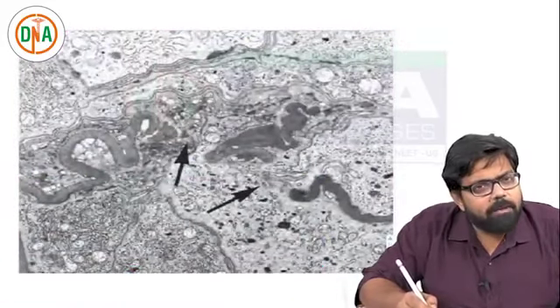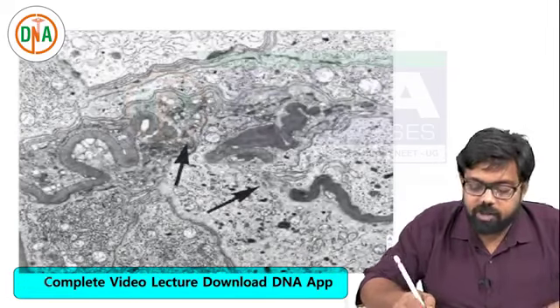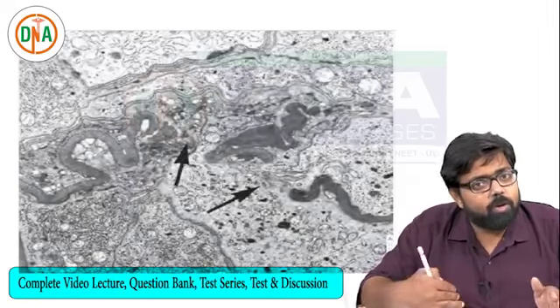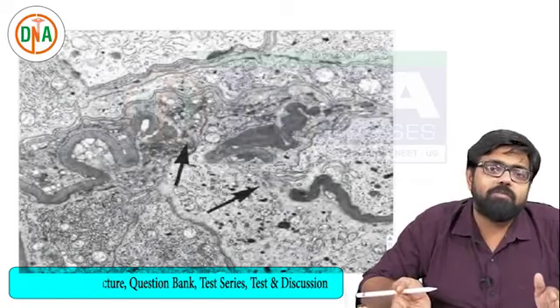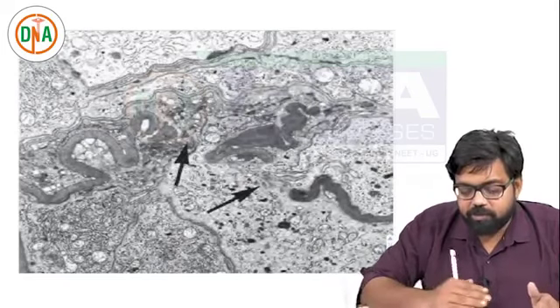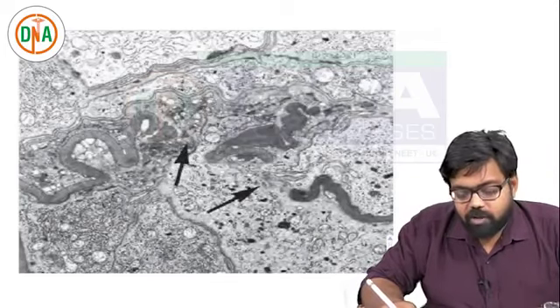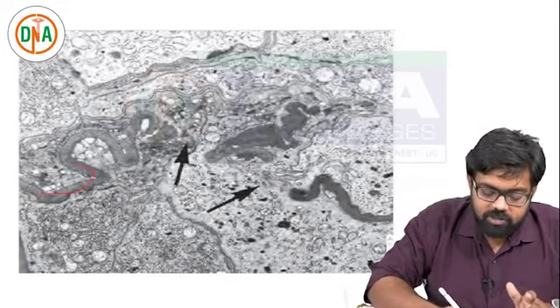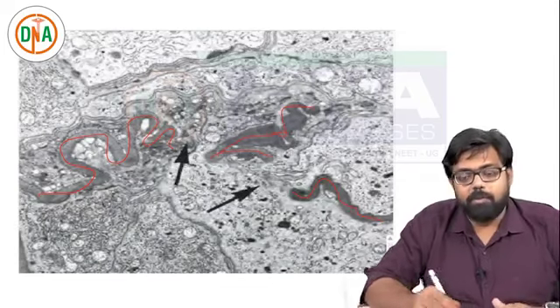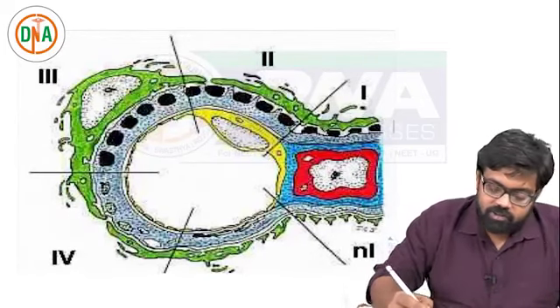What is pathognomonic and the hallmark of RPGN is rupture of the GBM. The easiest way to remember is that only because the basement membrane is ruptured can the macrophages and monocytes gain entry from the capillary into the urinary space and reach the parietal epithelium. So the pathognomonic feature of RPGN is always rupture of the glomerular basement membrane, which you can make out here. This is a basement membrane, here it has ruptured, and here is the other end of the basement membrane.